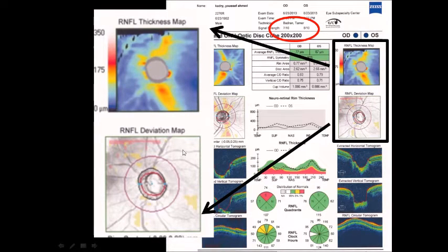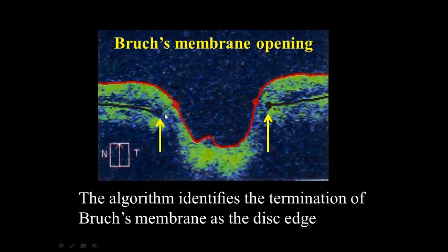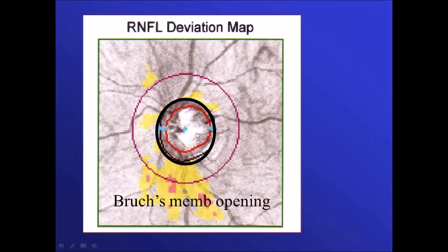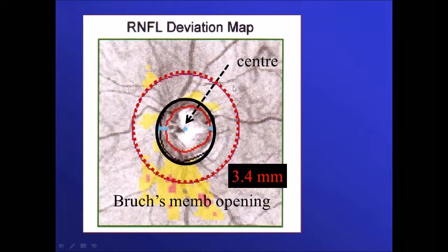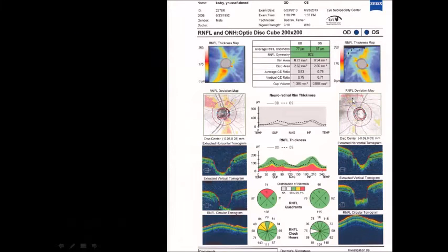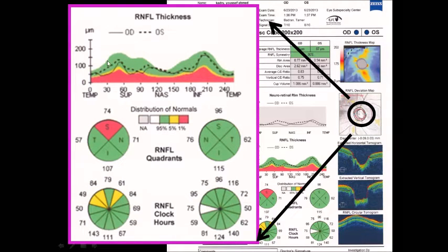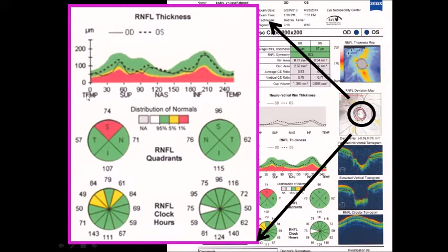The signal strength is good here. This area shows the thickness of the retinal fiber layer, and this is the deviation map — if the numbers are similar to the database it will be shown in gray, but if it differs it will be yellow or red. Yellow means it is found in only 5% of the population, and red means it is found in only 1% of the population. The machine determines the end of Bruch's membrane, then locates the center of the disc and draws a circle of 3.4 millimeters to calculate the thickness of the retinal fiber layer along that circle.